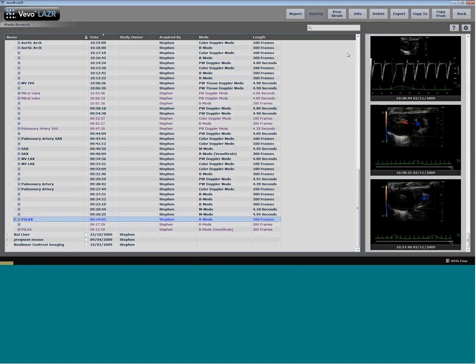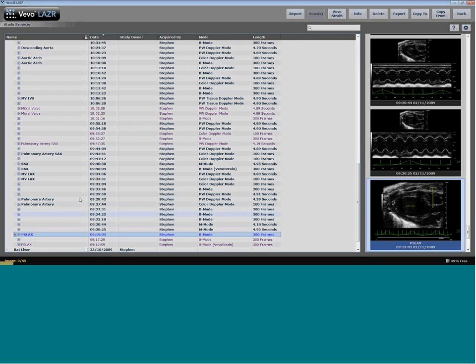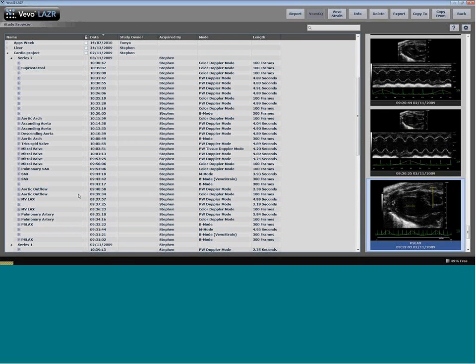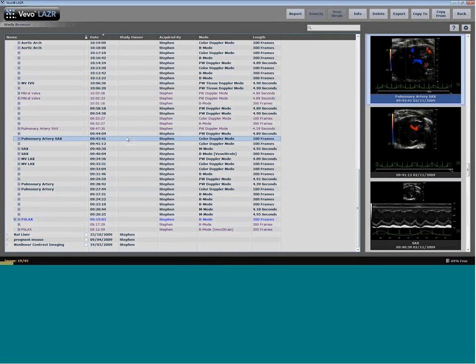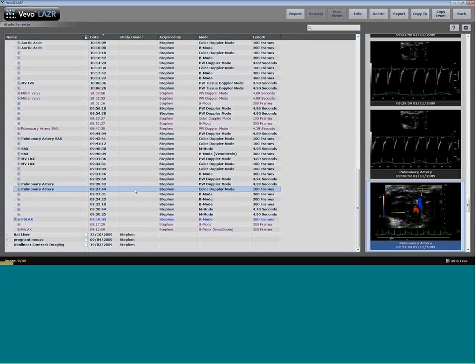Stephen, I'm going to throw this one at you. I'm not sure if you actually have any of this data or not. Just about aortic valvular flows and pulmonary flows. Do we have any of that data? And also for aortic stenosis and pulmonary hypertension. Okay. So general question just about those particular models, and I'm not sure if you have that data.